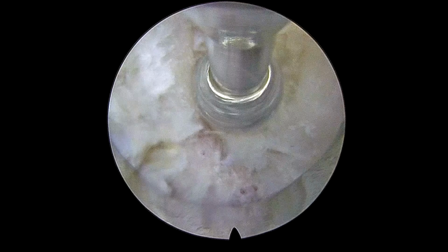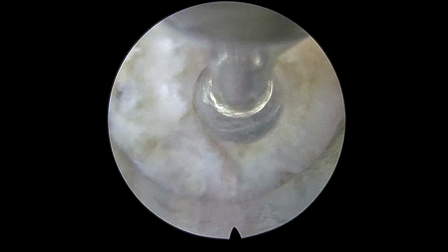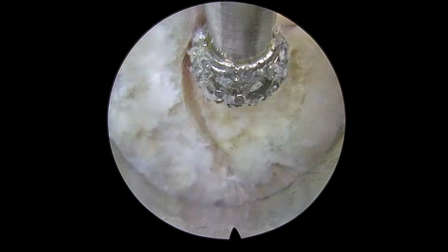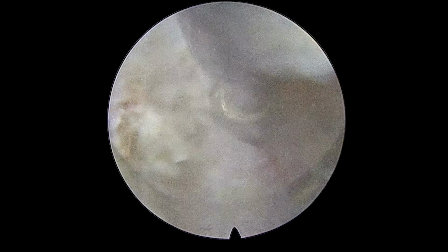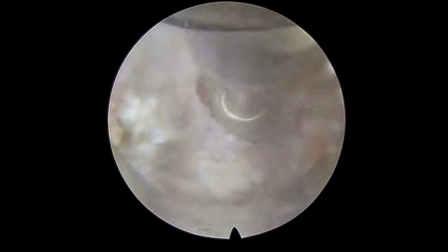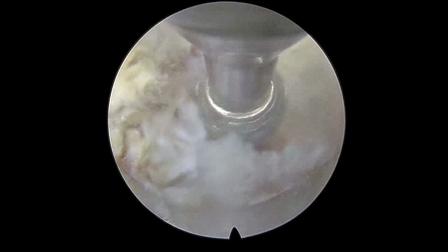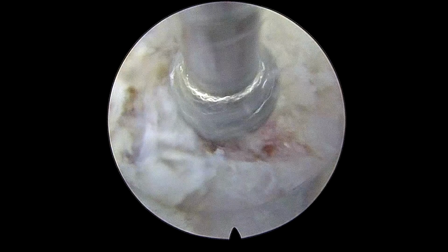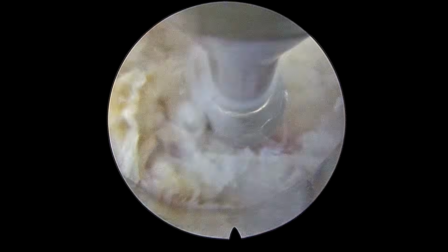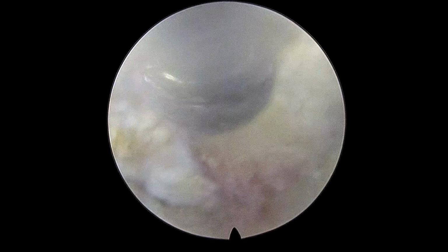In this case I am using the diamond burr. Ideally what I do is I start from the superior lamina. Start burring the superior lamina, then move towards the inferior articular process. So here I am just burring the inferior articular process. Once you have burred the superior lamina and the inferior articular process, then you can move towards the inferior lamina.